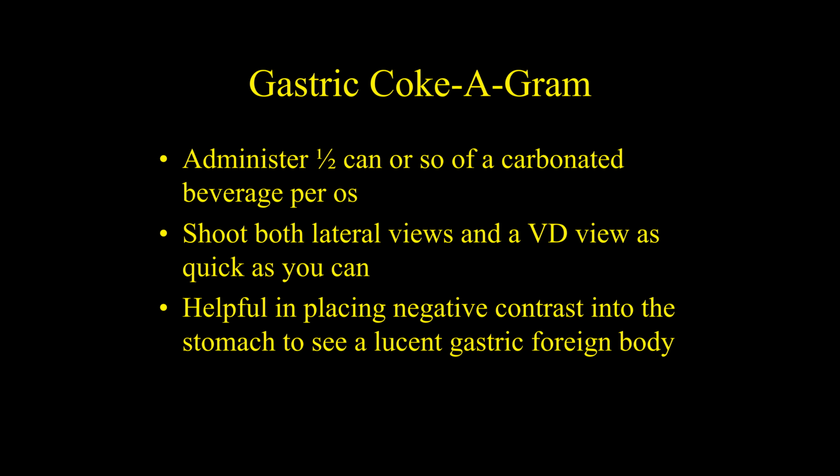So the idea of a cocogram, the dose is half of a Coke. You give it typically by mouth and then you shoot an X-ray, and that carbonation will blow the stomach up, or at least partially blow it up with gas, and allow you to hopefully diagnose something after you have filled the stomach up with gas. Again, the dose is half a Coke, because then you get to keep the other half and drink it while you're taking the X-rays.